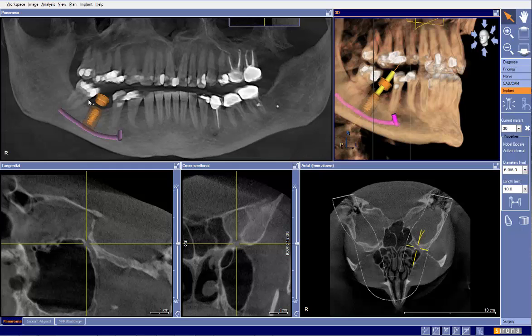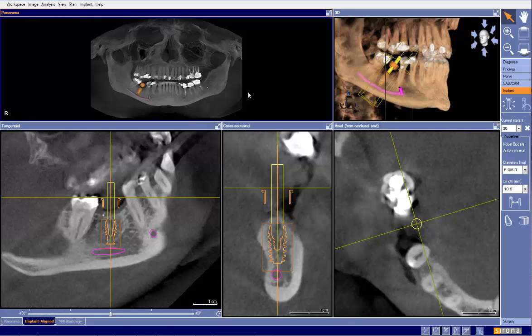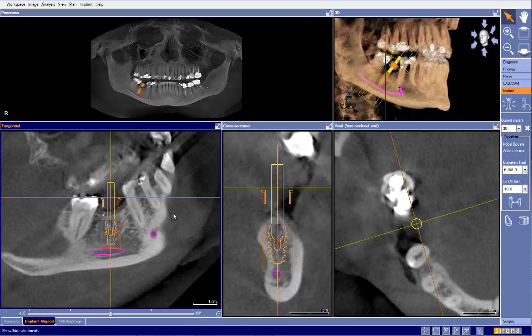This is a potential OptiGuide case. Let's take a look at site number 30. This case has been planned for a Nobel BioCare active internal 5x10mm implant. So if we think back to our checklist that we discuss in training, let's evaluate our case through the checklist.